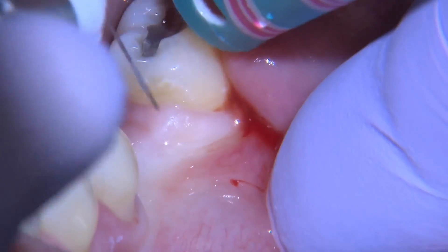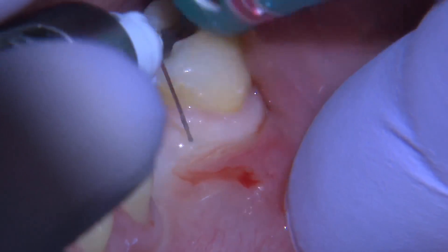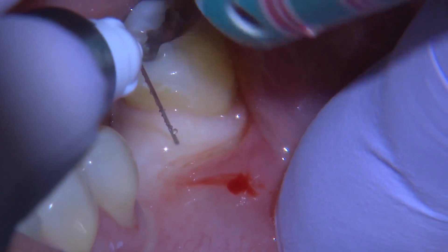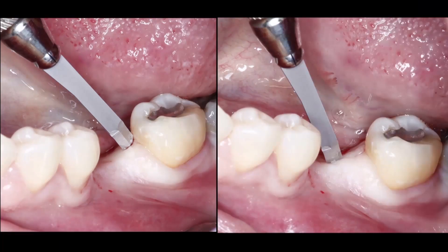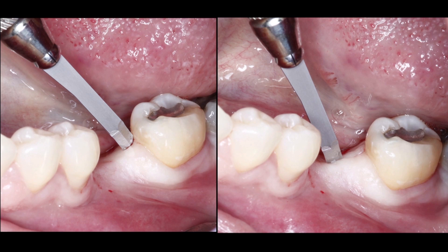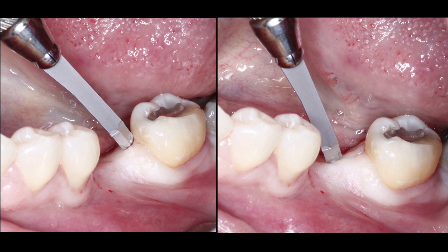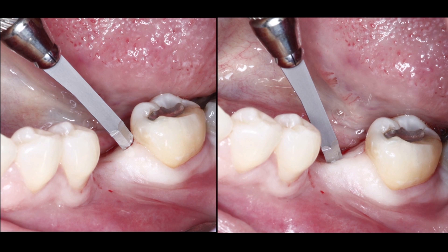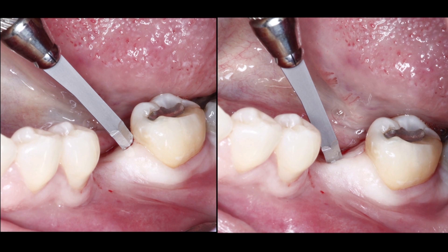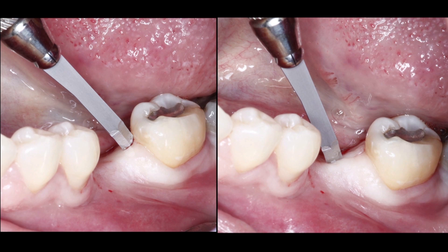Once I have the diagnosis down, I bring the patient back and provide some anesthetic with local infiltration. Once the patient is nice and comfortable with the anesthetic, I can go ahead and provide a full thickness flap reflection so that I can access the bone.